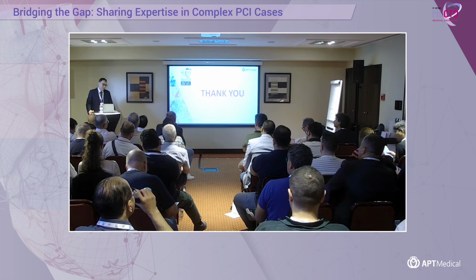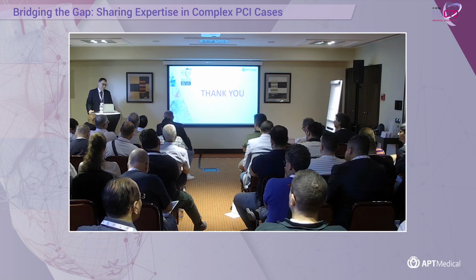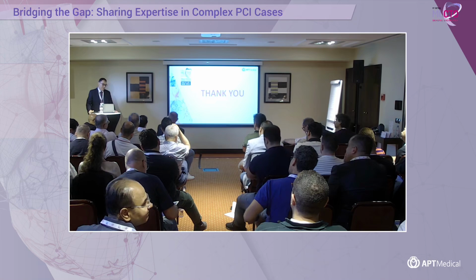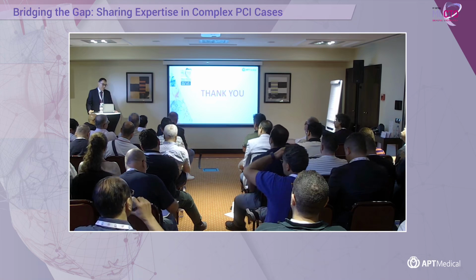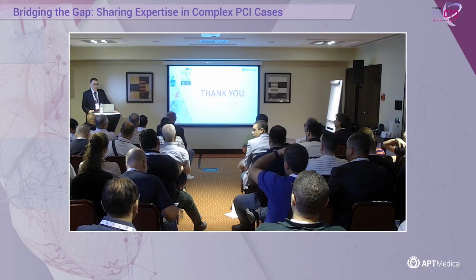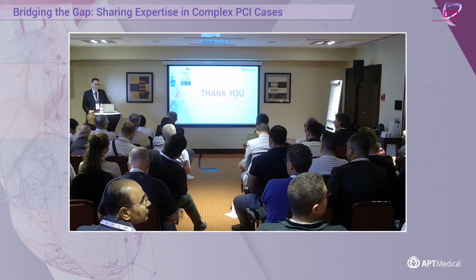So it's amazing, because I think, as you told, the way to treat and going from the left main to this LAD was much more difficult than going through the LIMA. And the result was very, very good. So I think also it's because one of the septals disappeared.